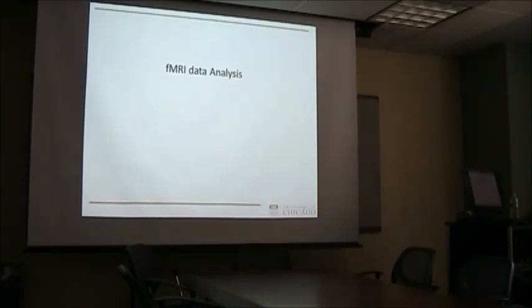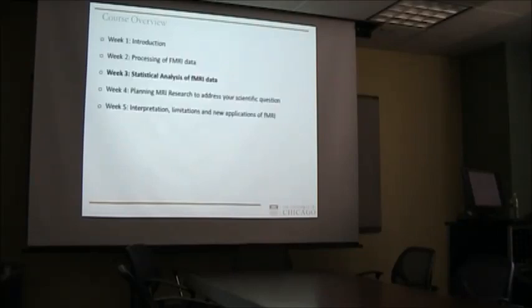So the topic for today's lecture and the demonstration is the data analysis of fMRI. So in the third week, last week we talked about the pre-processing of fMRI data.